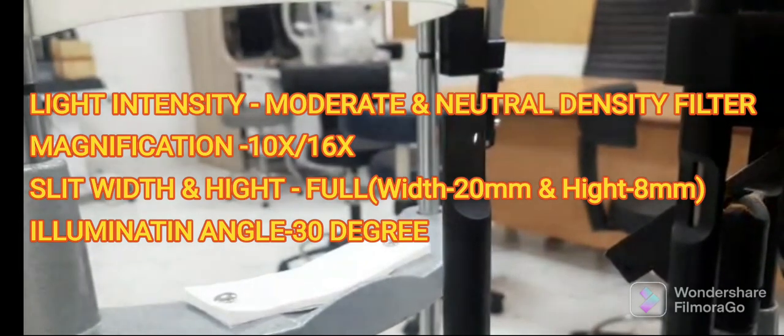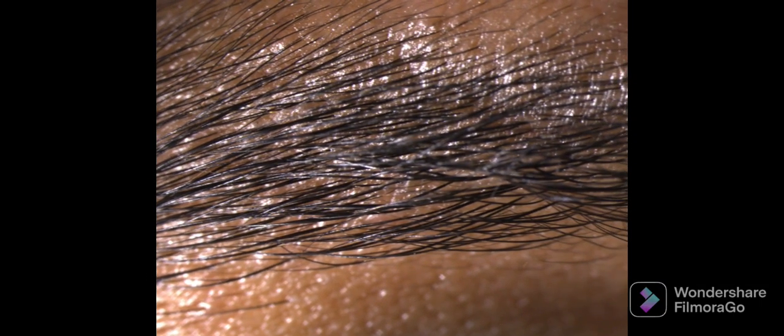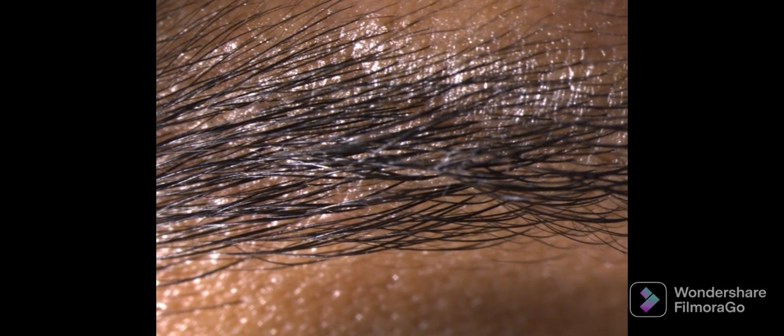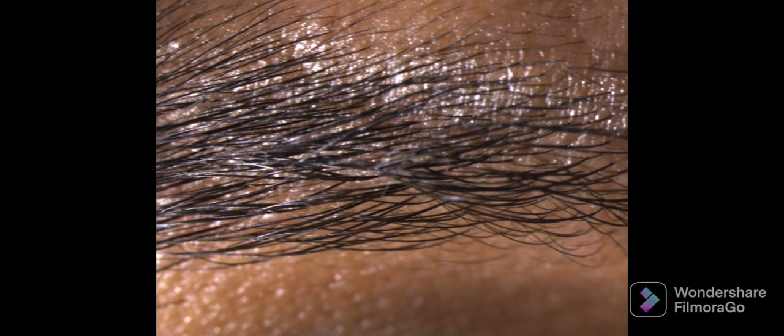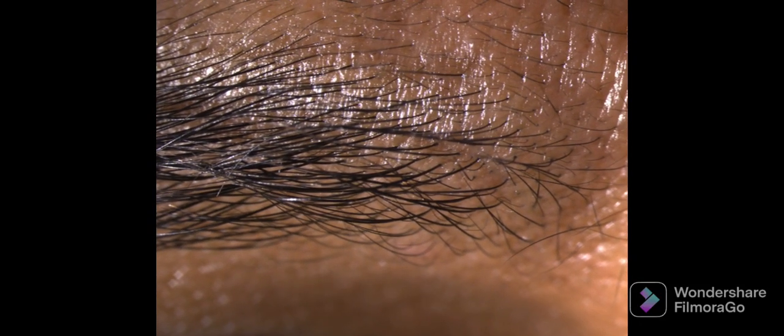The first structure to be examined is the eyebrows, which are examined for their color, density, and presence of any scales or deposits. This is a very basic thing that we have to observe first during the ocular examination in diffuse illumination.